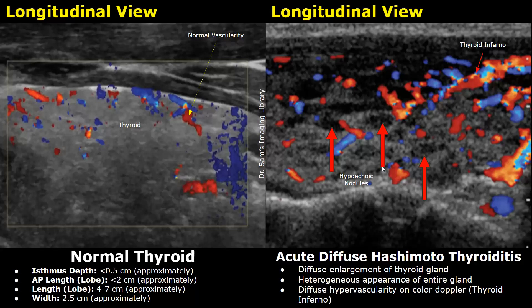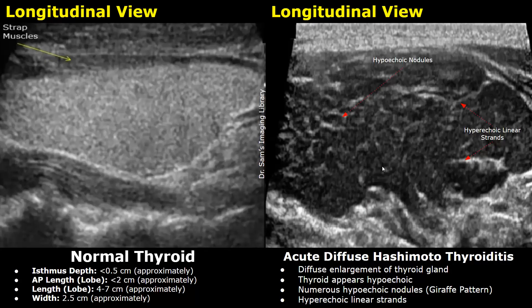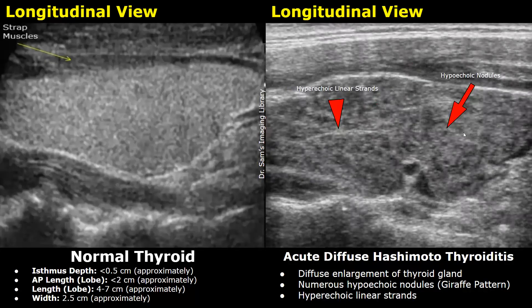In some cases, along with a hypoechoic heterogeneous appearance of the thyroid, you will find hyperechoic linear strands. These are seen in some cases of Hashimoto thyroiditis. This is another image showing hyperechoic linear strands within the thyroid in Hashimoto thyroiditis, where numerous hypoechoic nodules are also present.